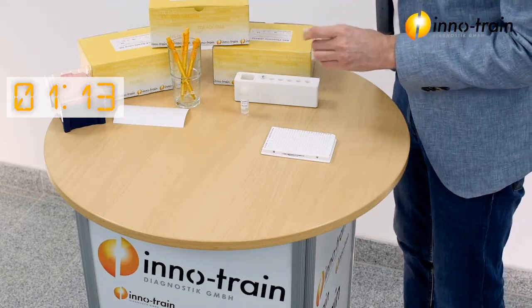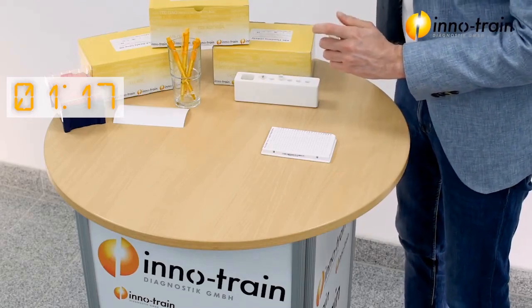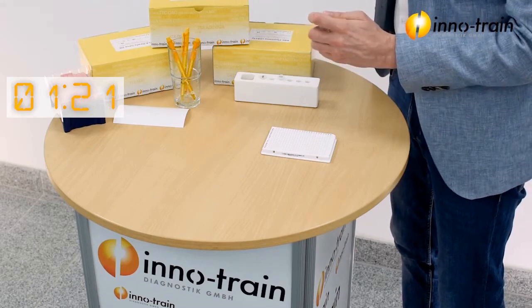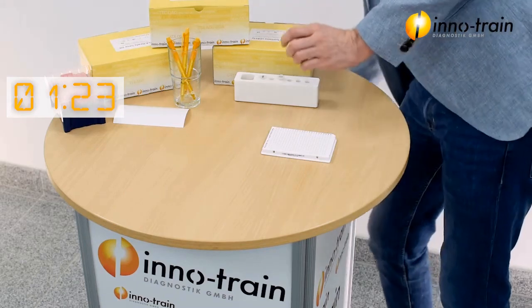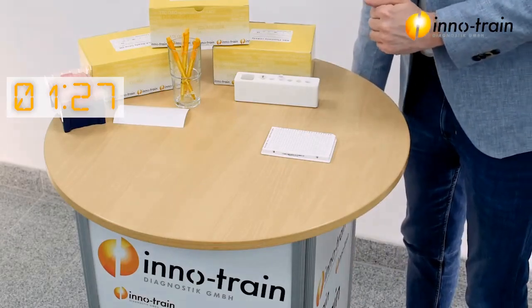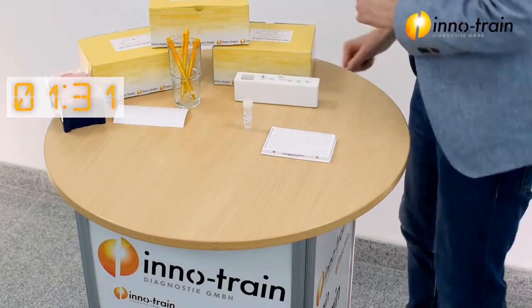And this we will add into our enzyme mix. So we have an end volume of 2.1 milliliters. This needs to be mixed or vortexed shortly. And then we can pipette that into the plate.